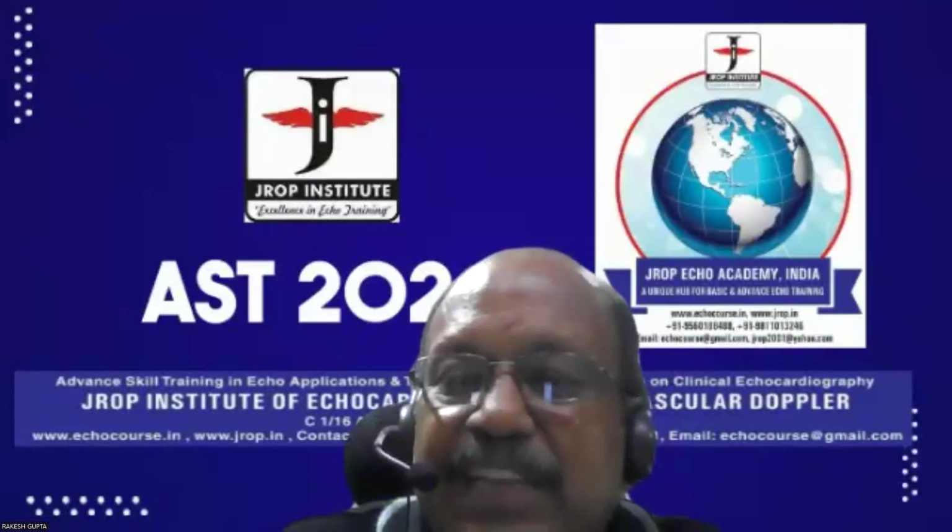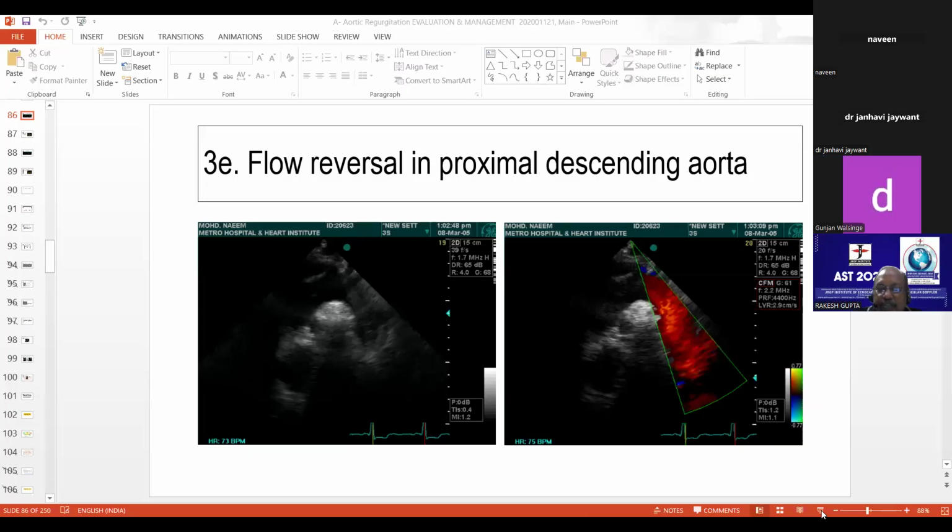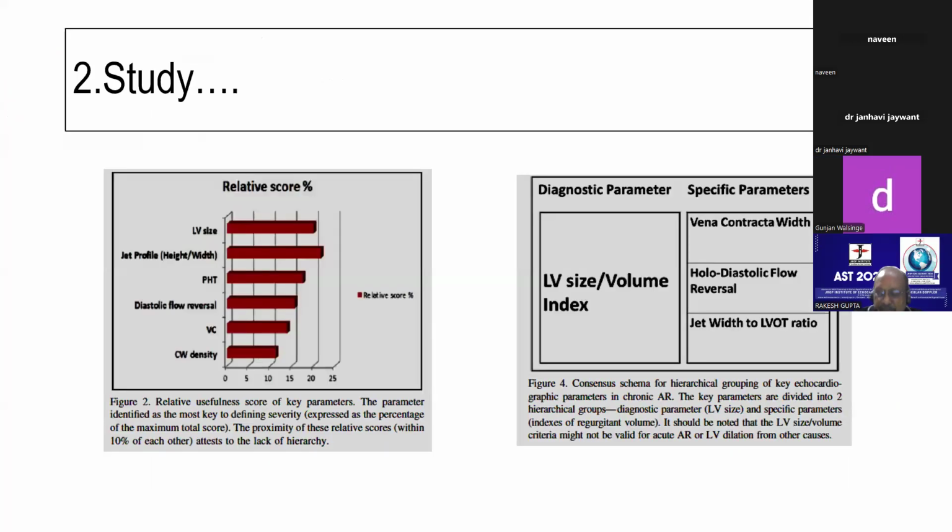I have a doubt in the color scaling. There is a green color which is seen at both ends of the spectrum. I mean, that is the variance scale of a color map. How should we interpret it if even in the holodiastolic reversal I could see the green? Sir, there is no green color in holodiastolic reversal flow. Look where it is.